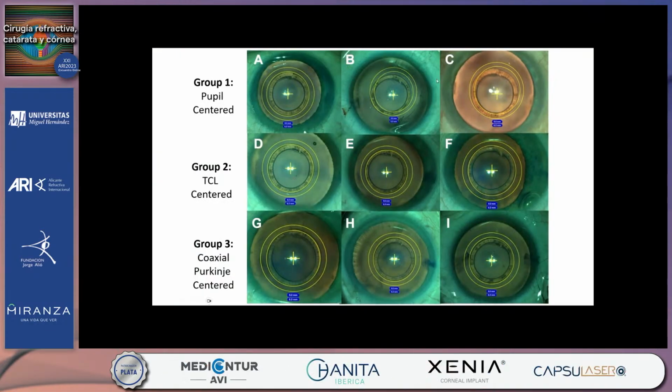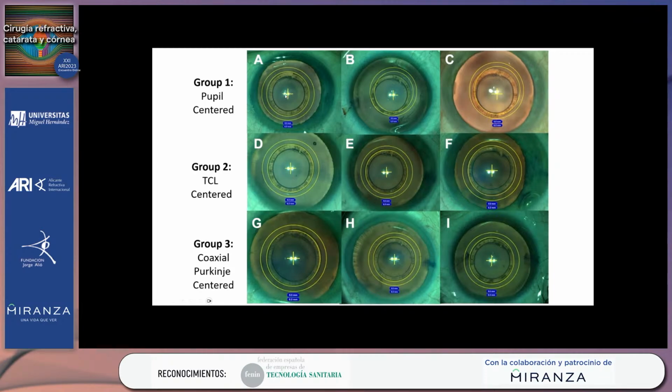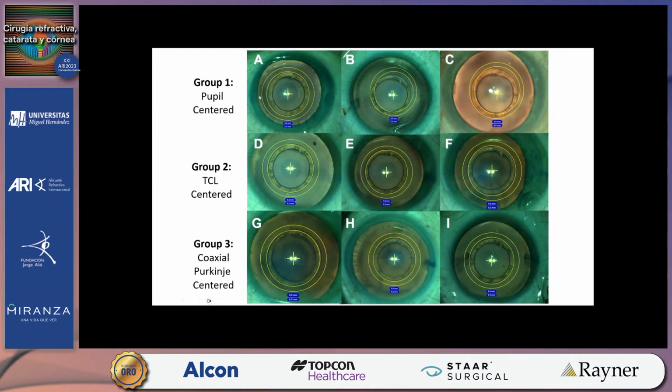To verify the results, we used Callisto Eye, but the reference matched the IOL Master data. Here is shown the visual axis as measured by the IOL Master, and superimposed on here a diameter of 5mm and then 6mm.